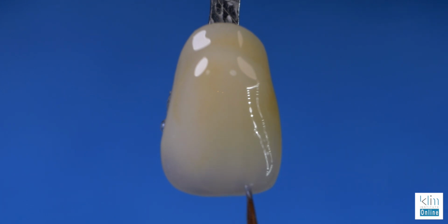Once our low value is in place, we'll take the tip of that brush, mix the Storm into the smoke, and create that striation effect between the mamelons down from the incisal depression. So what we're doing here is building that incisal effect, bringing in the low value, accenting with Storm, and then we'll contrast using higher value options.